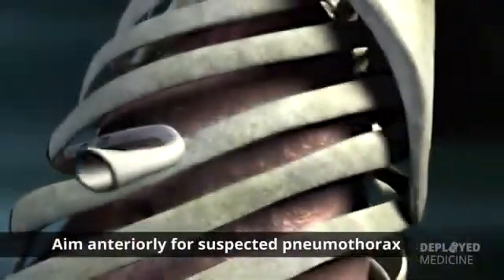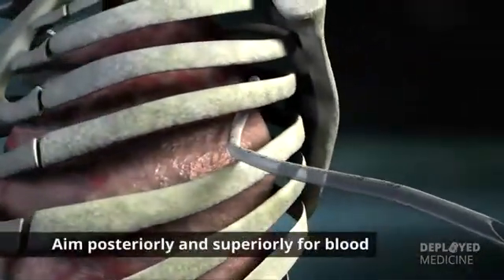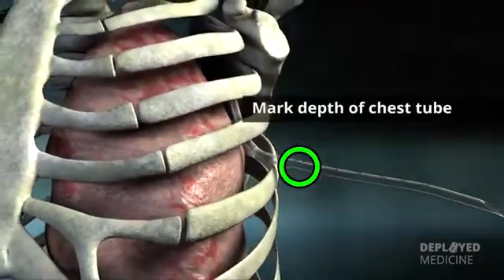Remember, when inserting the chest tube, you want to try to aim anteriorly for a suspected pneumothorax or aim posteriorly and superiorly for suspected blood, and then mark the depth of that chest tube.